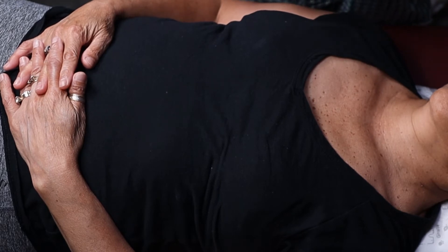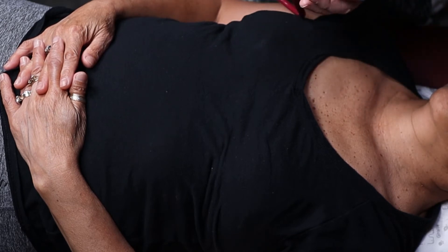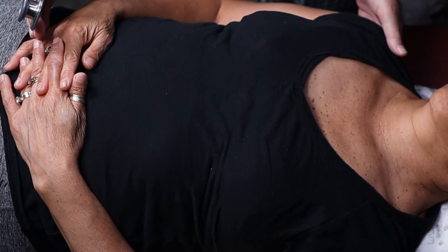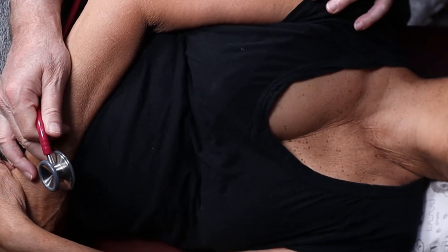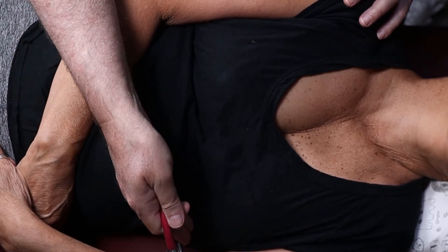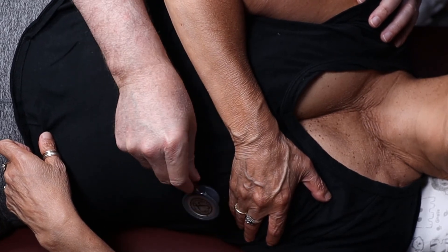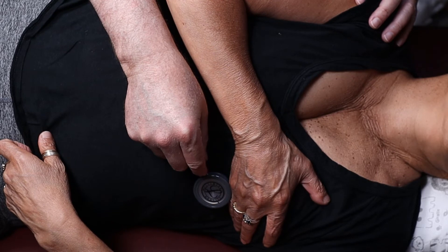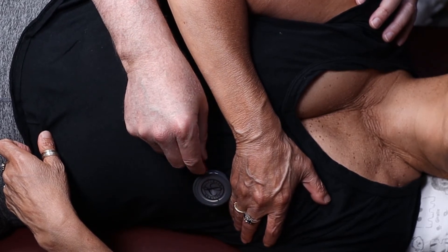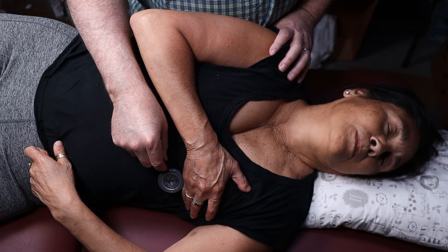Now, if I ask you to check for an S3 and S4 heart sound, we have to flip over to the bell. We need to have the patient roll a little bit to the left — just a little bit on your left shoulder. We don't want her going all the way, but this is perfect. Could you take your breast tissue again and pull it up? With the bell, we're going to listen right at the mitral area. S3 and S4 heart sounds are both heard at the mitral auscultation area, but to bring them out you have to put the patient in the left lateral decubitus position.